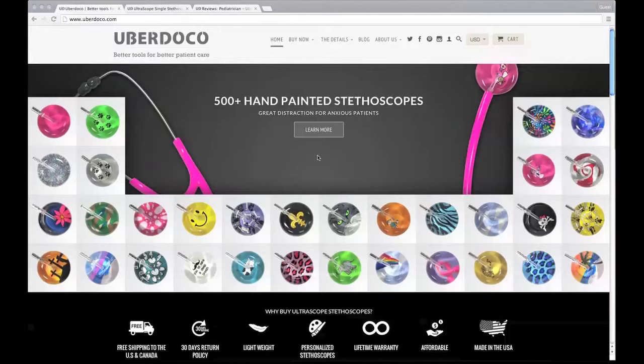Today we have this fantastic new product — it's a stethoscope called the Ultrascope stethoscope. What we really love about this particular stethoscope is that they have more than 500 plus hand-painted stethoscope designs in beautiful, vibrant, and engaging colors. The beautiful thing about this manufacturer is that they actually offer a lifetime warranty on all parts of the stethoscope, which is fantastic.